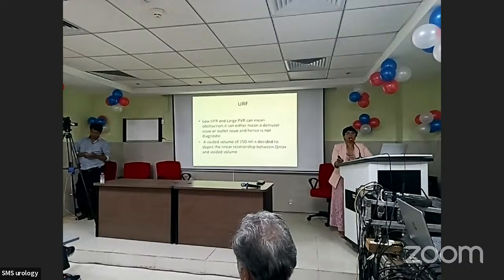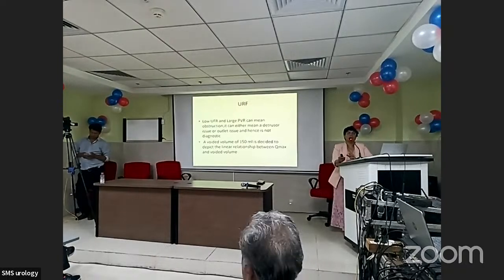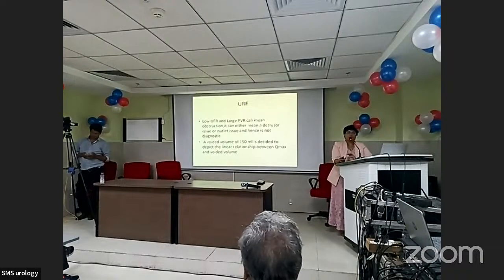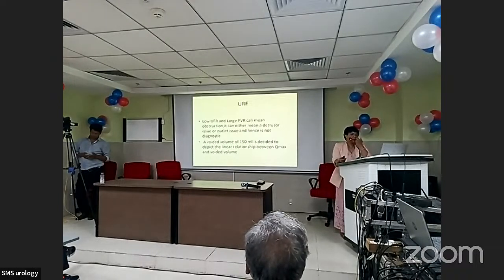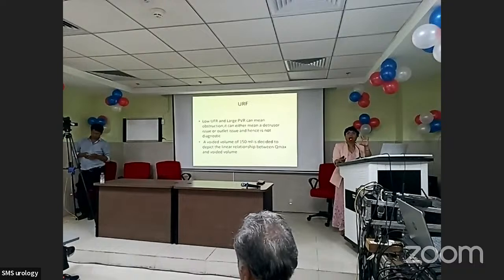So three things will diagnose obstruction, which is very easy for us. I'll take you through it in the last session, where we also have graphs to explain. So a high PDET, a low UFR, and a large post-void residue. This is mostly the broad definition of obstruction.